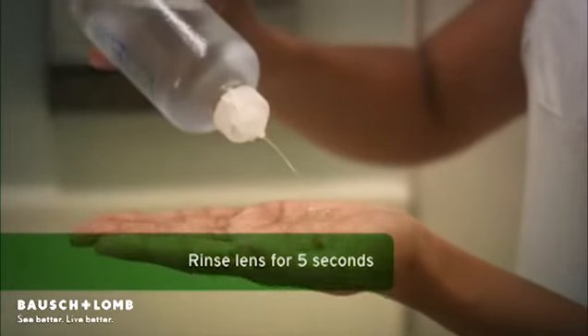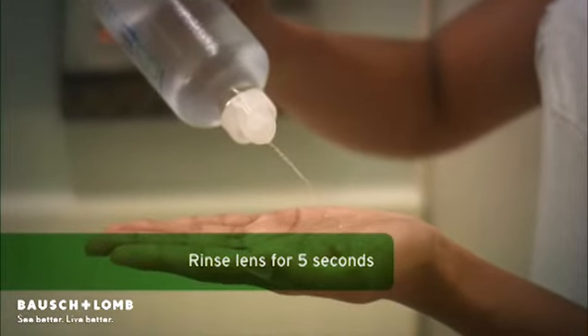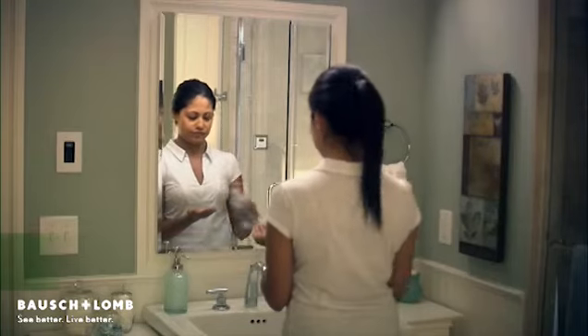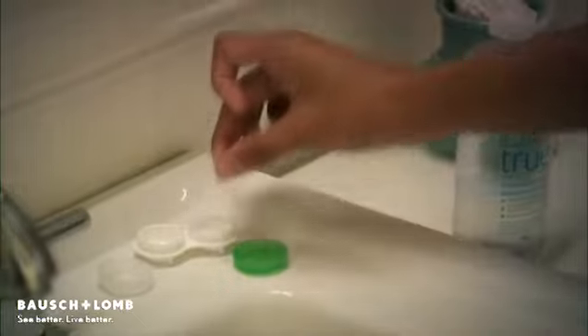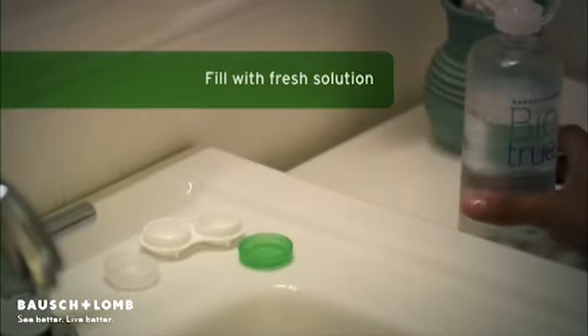Thoroughly rinse each side of the lens for 5 seconds with the solution. Place your clean contact lens in the lens case and fill the lens case with fresh Biotrue Multipurpose Solution and soak for at least 4 hours.